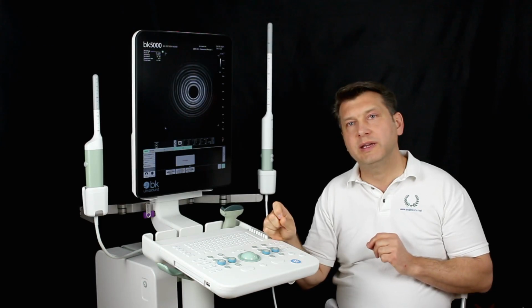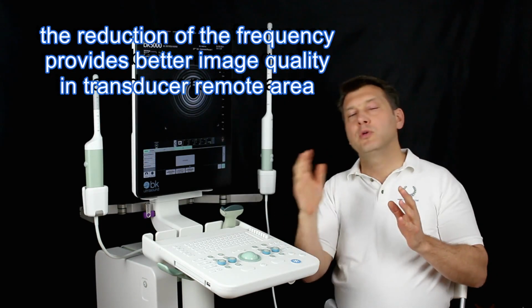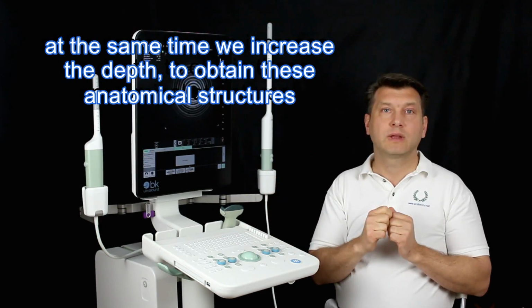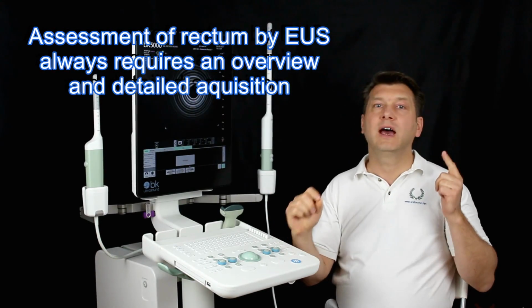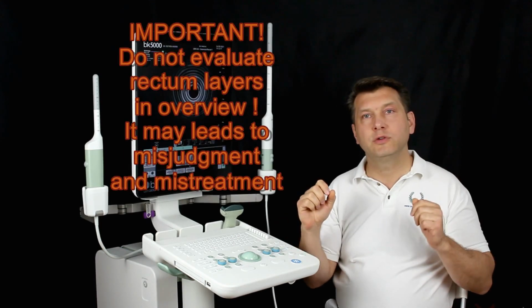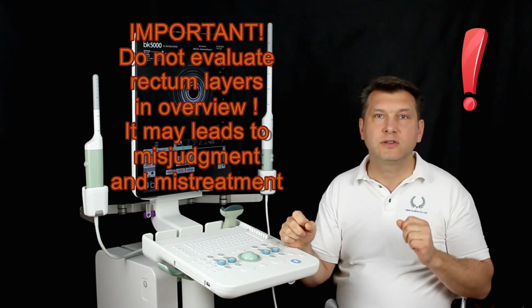In the overview display, the frequency should be reduced to improve the image of the probe remote areas. At the same time, the depth is increased. Other values may remain unchanged. In order to assess the rectum, it is necessary to carry out a double examination, an overview and a detailed examination. It is important not to assess the rectum layers in an overview. This leads to misjudgments.